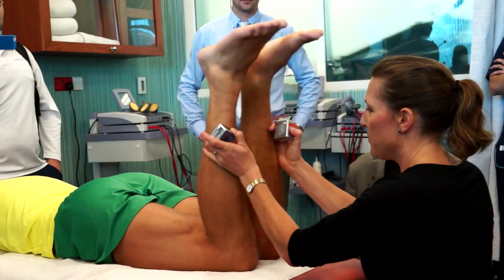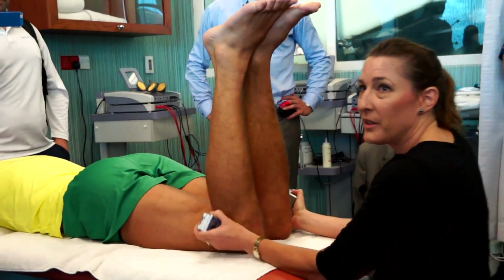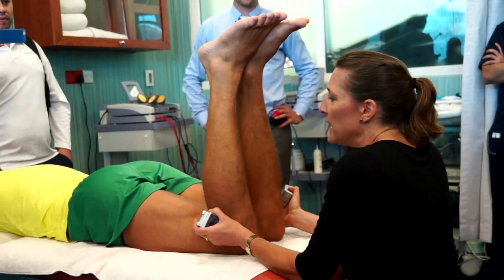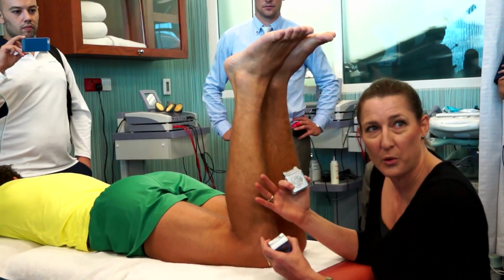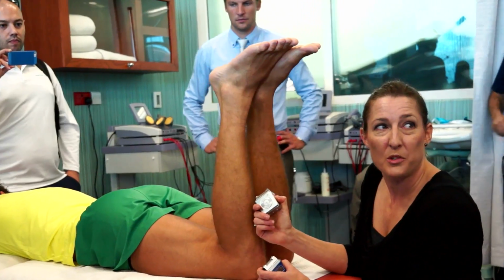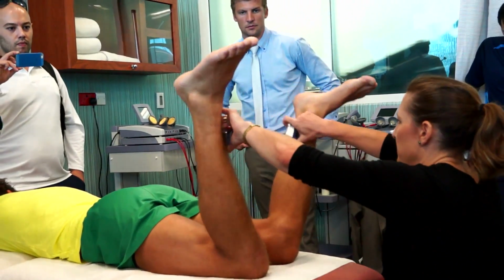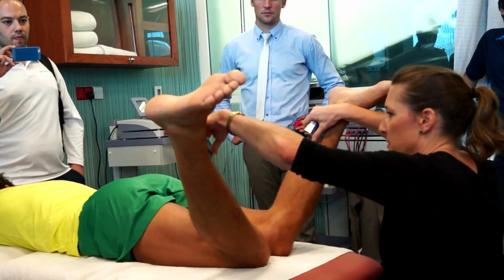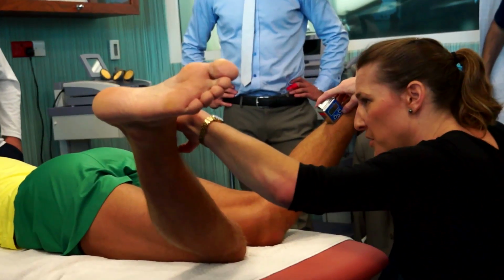And we chose not to use that because we were confident in this position that we could eyeball that very well. And the use of a set square would have just created an extra piece of equipment and an extra bit of time, which we were not keen to do with our screening. So, as with all of these tests, choose the best that you have given the circumstances.